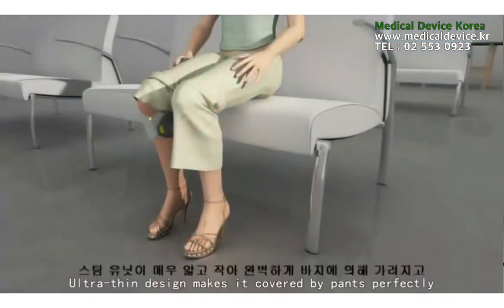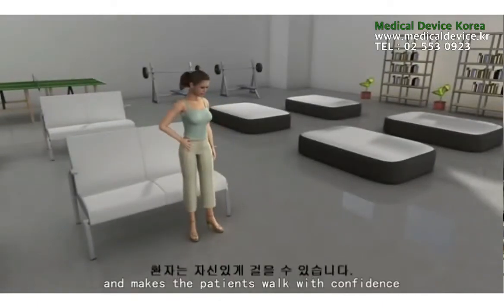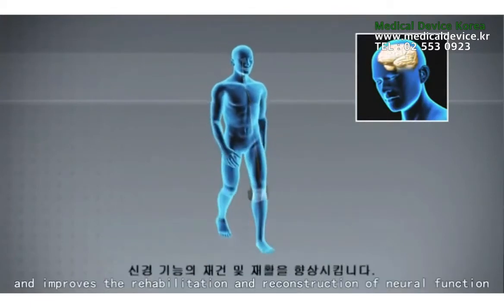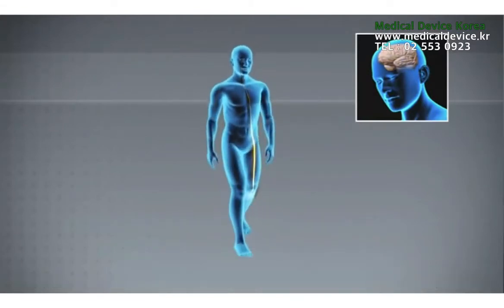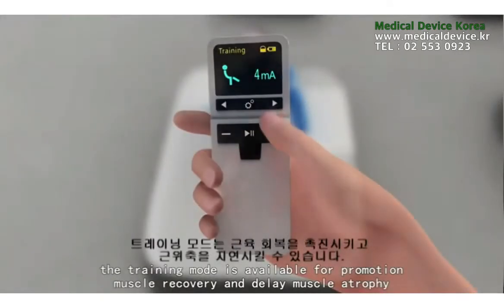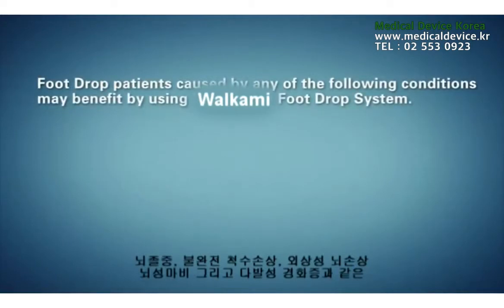The ultra-thin design makes it perfectly covered by pants, allowing patients to walk with confidence. The repeated patterns of stimulation while walking excite the cerebral cortex and improve the rehabilitation and reconstruction of neural function. For patients who lack active training, a training mode is available to promote muscle recovery and delay muscle atrophy. The remote control can be used to select the training mode.